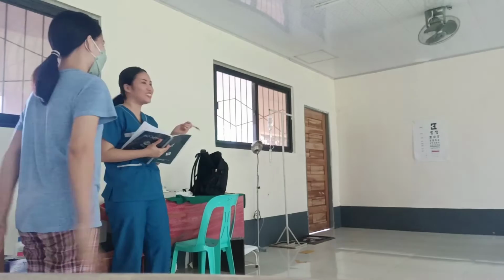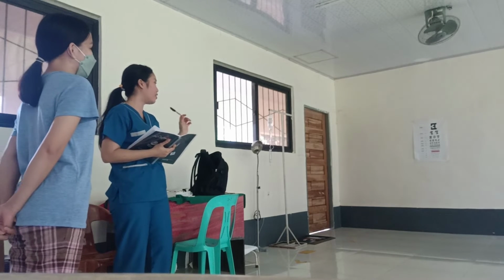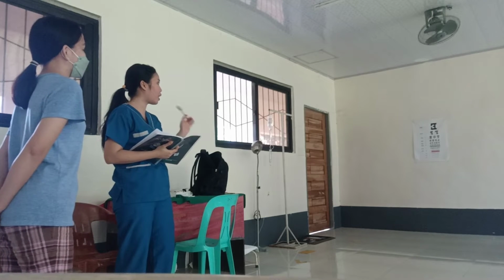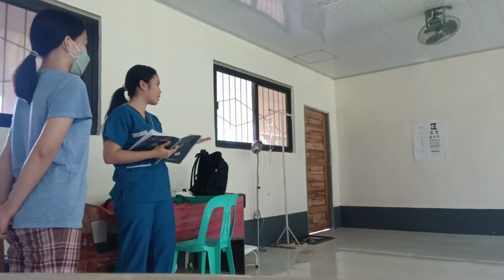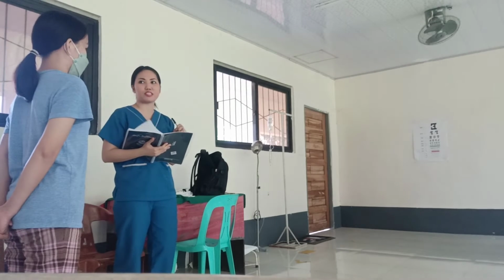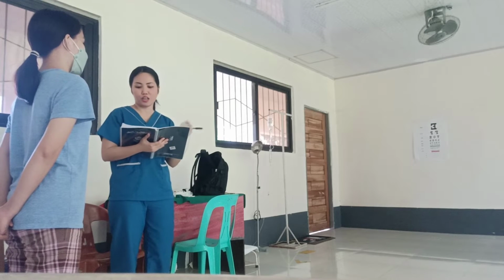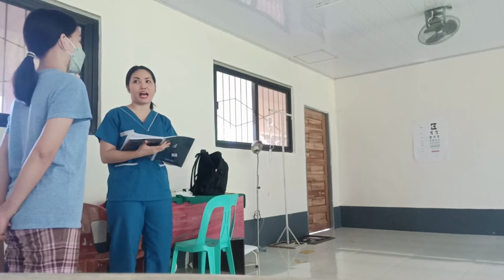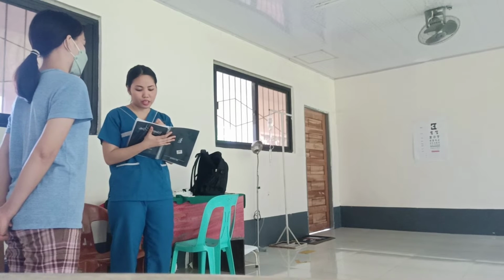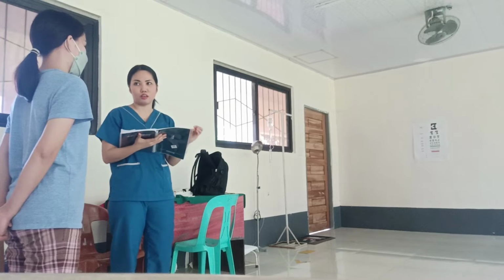Okay. So I can see that you can distinguish the letters which a person with normal vision can distinguish at a 20 feet distance. That indicates that you have a normal distant visual acuity. So I will take note of that. Your visual acuity is 20 over 20.